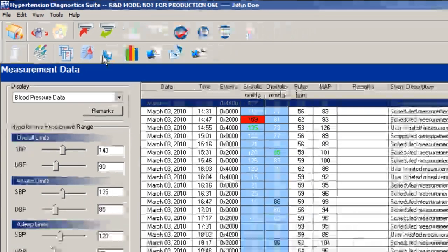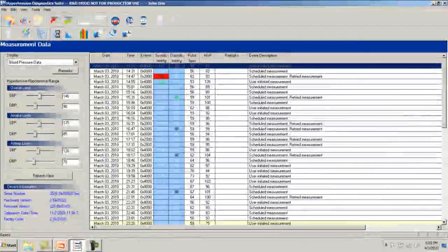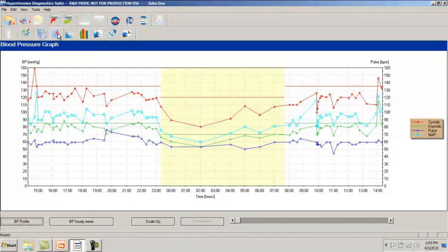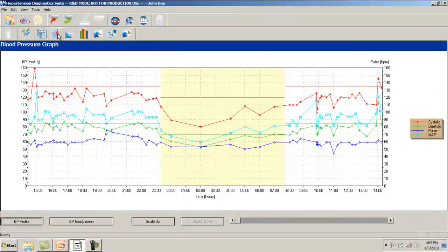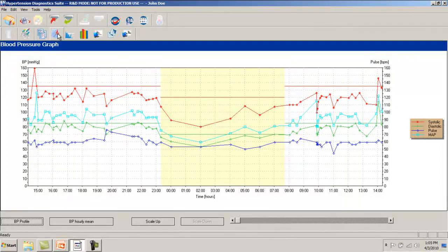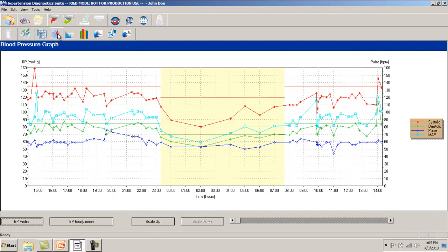The graphical view displays the blood pressure and pulse information such that fluctuations over the monitoring period can easily be seen. Such things as the nighttime dipping, the morning rise, as well as unusual measurements can easily be identified in this graphical view.